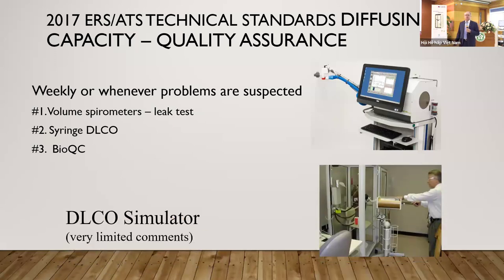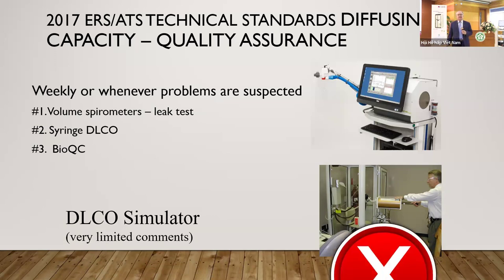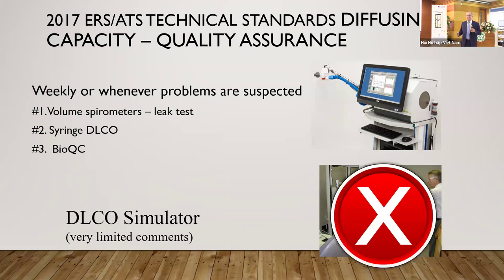There is a more sophisticated way of evaluating diffusion of the lung, but it's very expensive. So even though it was discussed, it really wasn't meant that people need to do it unless maybe you're doing research or something like that. Because in order to use that unit, it's about $5,000, so very expensive to purchase.